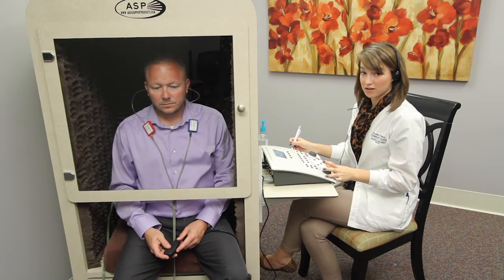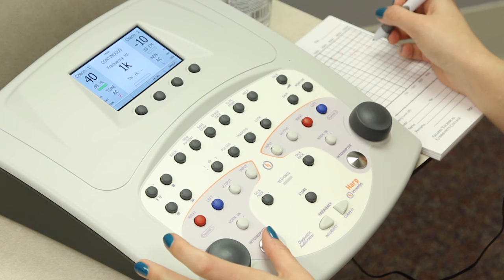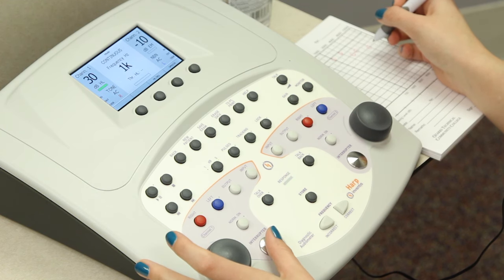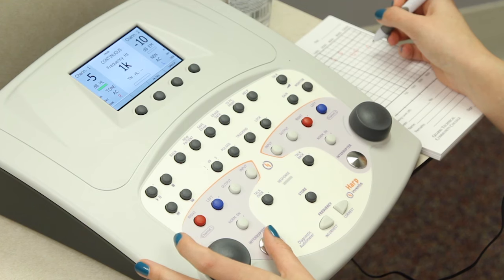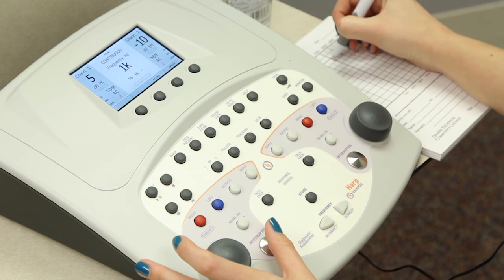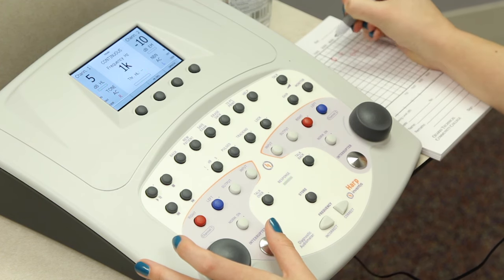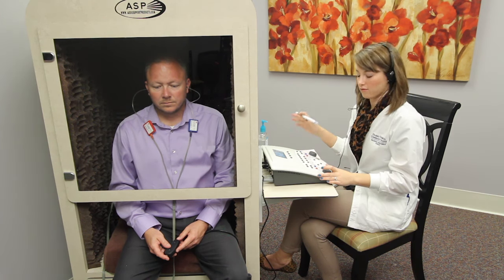Now we're going to go back to 1000 Hz and verify that our threshold was correct. Our patient has the same threshold, and that means that our high frequencies were a reliable test. So we have reliable thresholds.